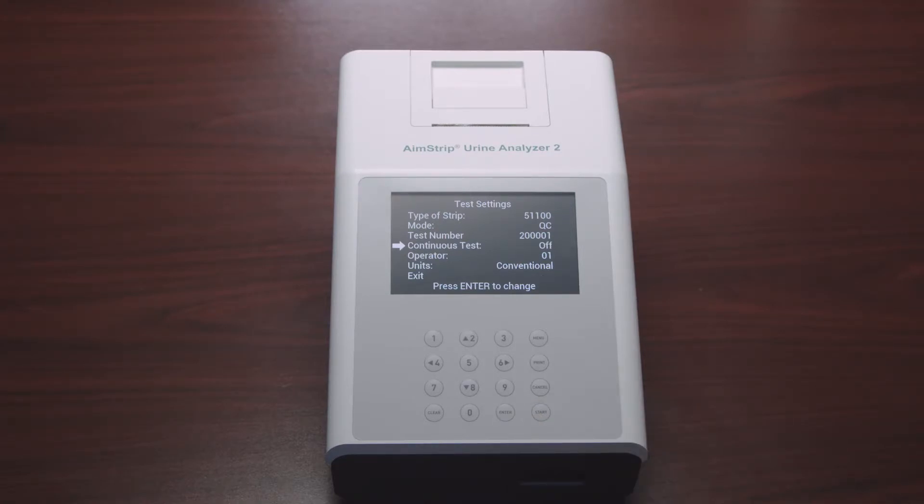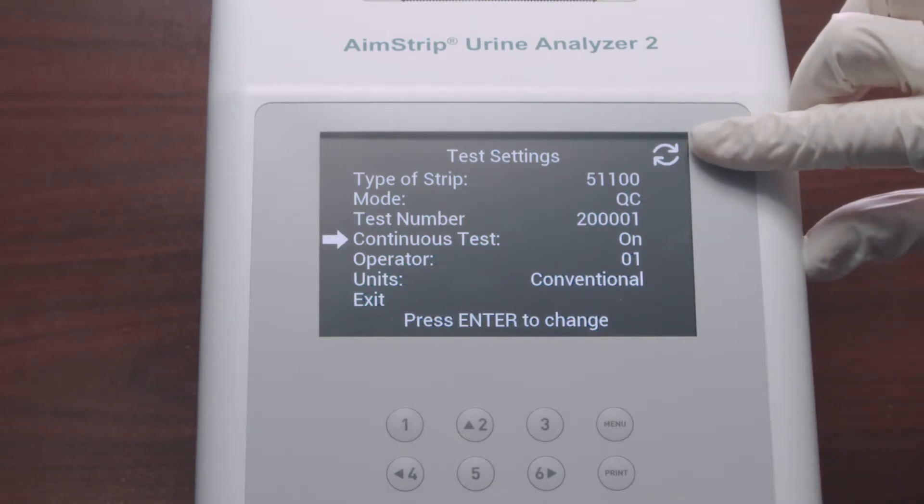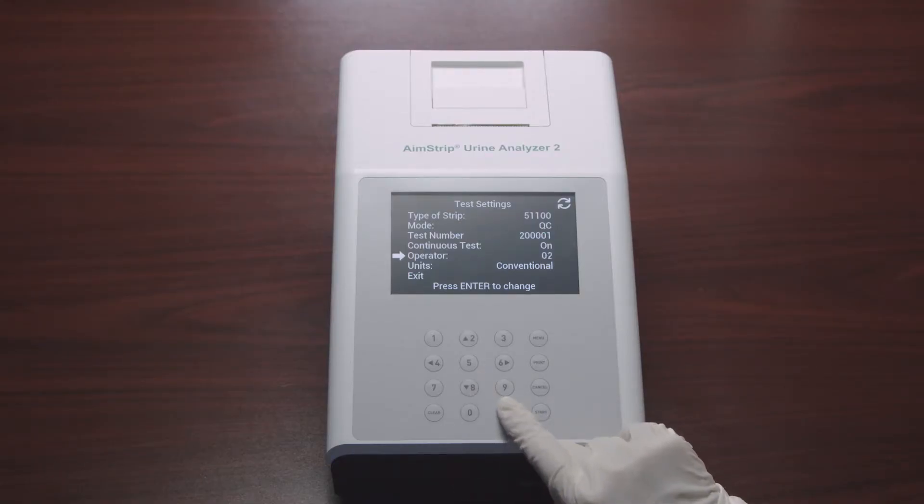If Continuous Test is Off, you can test one strip at a time — also called single test mode — which performs 60 tests per hour. If Continuous Test is On, you can use test strips one after another; continuous test mode performs up to 120 tests per hour, and the circled arrow symbol will be displayed. Next is Operator: select Operator ID and press Enter to increase the number by one; after the number reaches 10, it reverts back to 01.